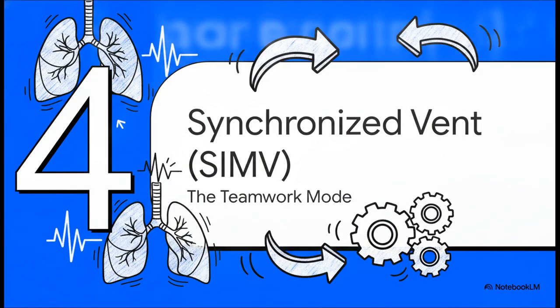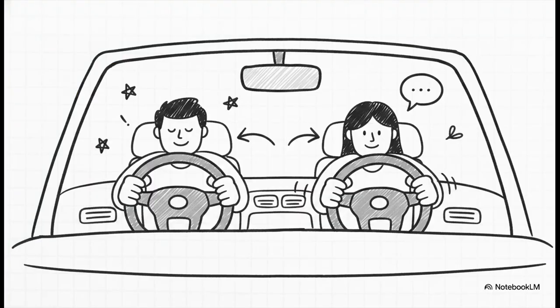Part 4. Synchronized ventilation, or SIMV. If assist control was the chauffeur, SIMV is a lot more like a driving instructor with dual controls. It's all about teamwork. The machine still delivers a set number of mandatory breaths to ensure the patient gets enough oxygen. But in between those mandatory machine breaths, the patient is totally free to take their own independent, unassisted breaths at whatever volume they can physically manage.